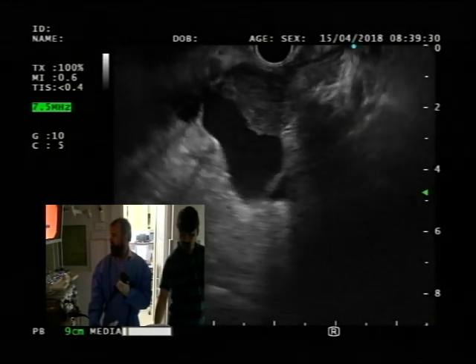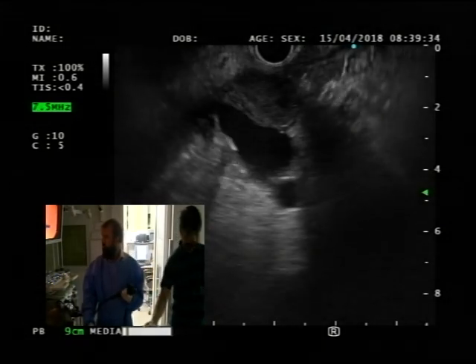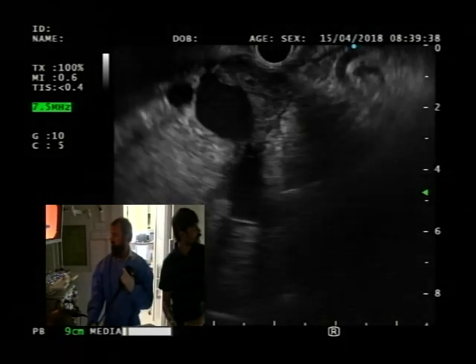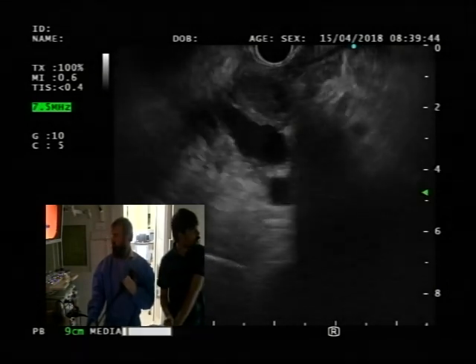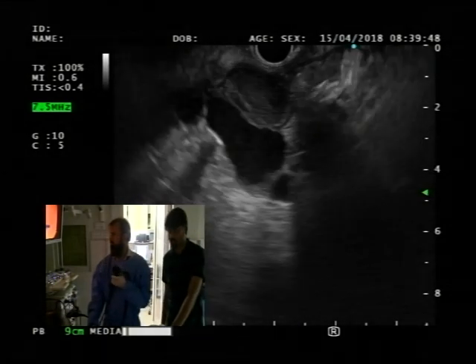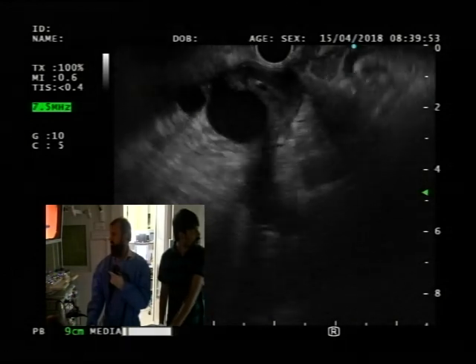Needle बाहर नहीं है. It's a really nice case. So वो क्या कह रही हैं कि क्लॉट लग रहा है? Unless there is a tumor hiding in there, but we got some tissue there. I won't make a second pass because you are going into the vein right now.